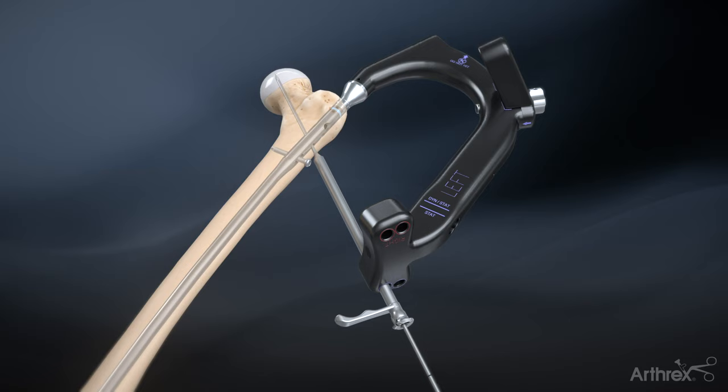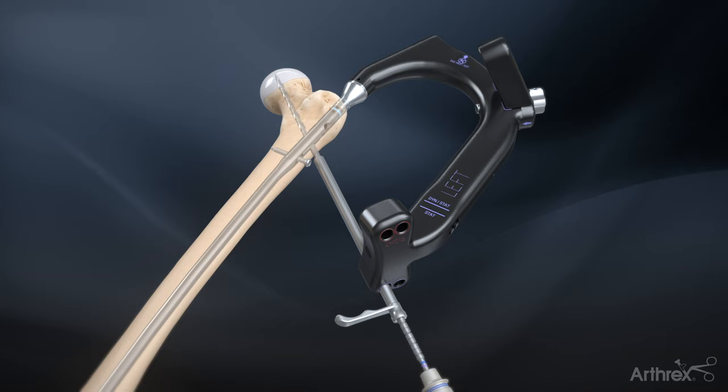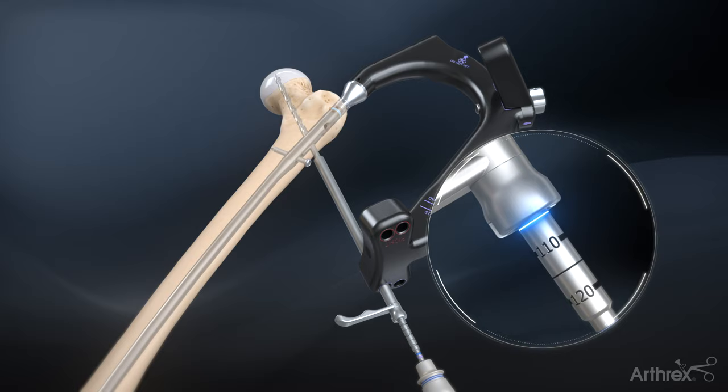Remove the pin guide and drill using the 5.5 mm calibrated cannulated drill over the guide pin to the appropriate depth by using the calibration marks on the drill.